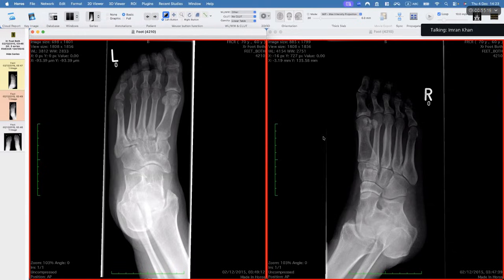Okay. So what would be the pathophysiology of osteoarthritis? Okay, forget pathophysiology. What are the hallmarks of osteoarthritis on imaging, on X-rays? On X-rays, sir, for osteoarthritis, initially there will be a reduction of the joint space.